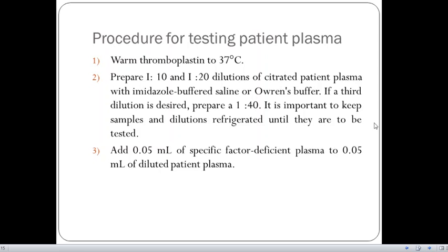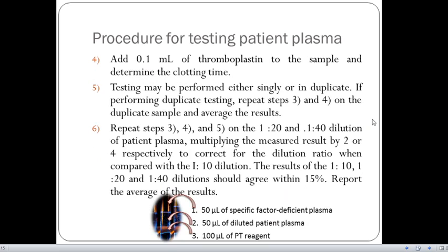And if a third dilution is desired, prepare a 1 is to 40 dilution. And it is important to keep the samples and dilutions refrigerated until they are tested. For number third, we have to add 0.05 ml of specific factor deficient plasma to 0.05 ml of patient plasma.